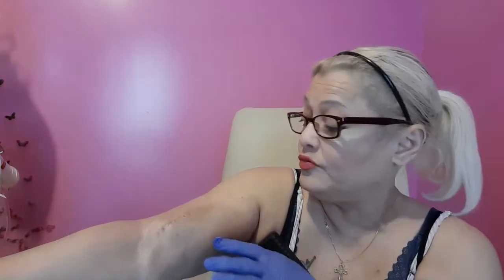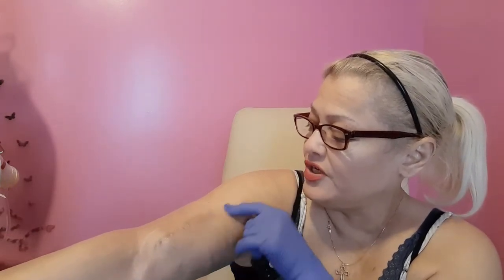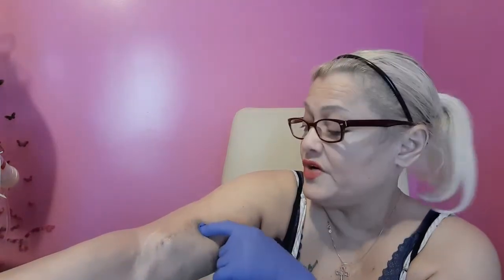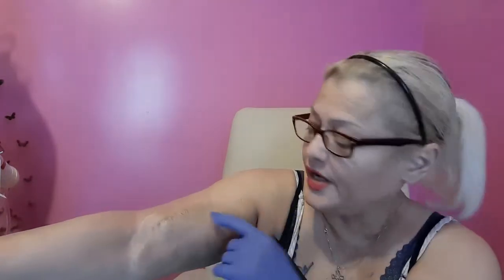This is the one that has caused 23 infiltrations. And sometimes she'll make him infiltrate. So I have to stick as close to the bottom as possible until I go see the surgeon, and they go back in there for the third time and try to fix her up. For some reason, she won't hold the needle. It'll just blow. So we're avoiding this until I see the surgeon. I see him this Friday.